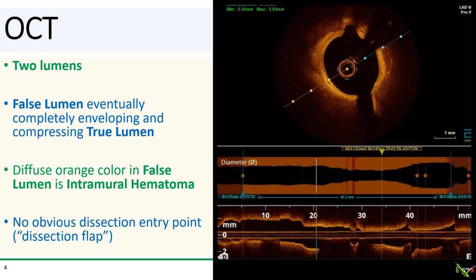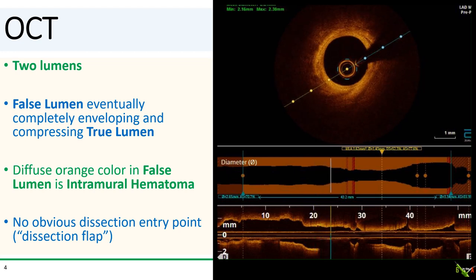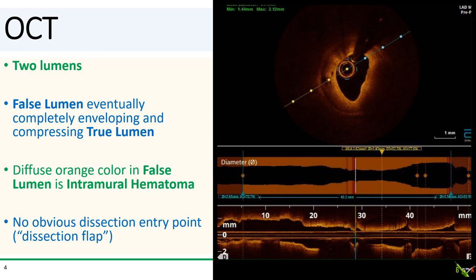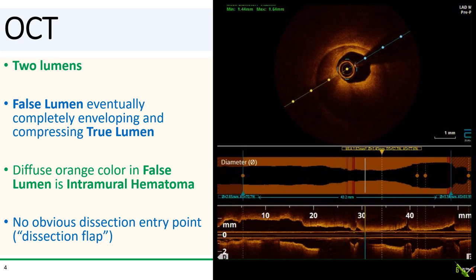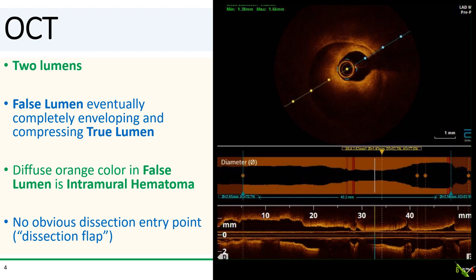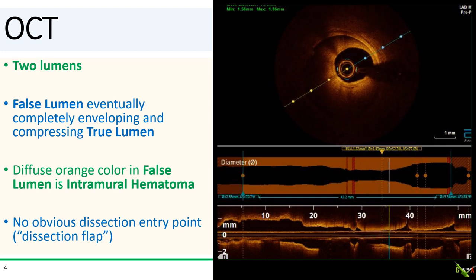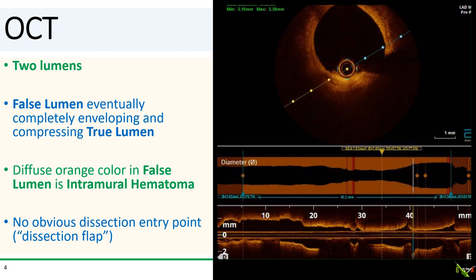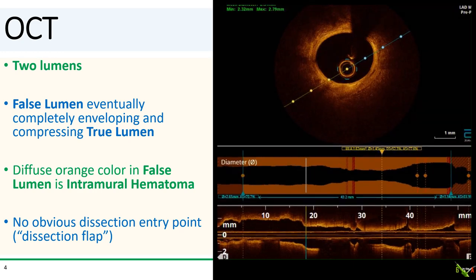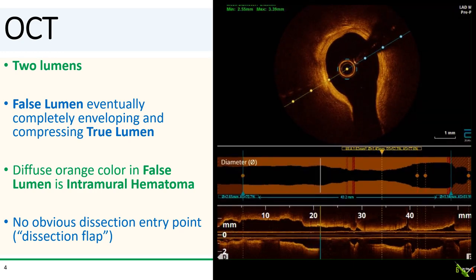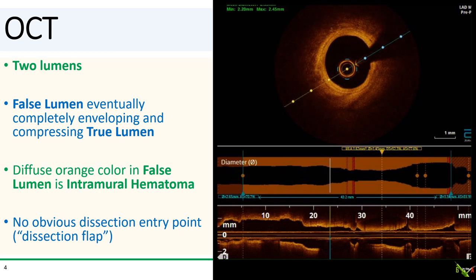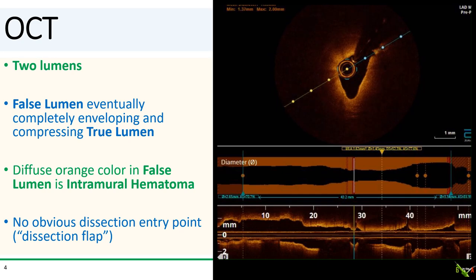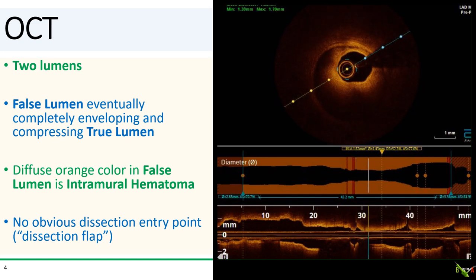So, here is the OCT run. Let's look at it carefully. As we move through the run, you see one lumen becoming two lumens — this is diagnostic for a dissection. The false lumen eventually completely envelops and compresses the true lumen. You'll see a diffuse orange signal in the false lumen, which is intramural hematoma. And if you look carefully, there actually is no dissection flap — there is no point at which the false lumen communicates with the true lumen. This is a case of SCAD, or spontaneous coronary artery dissection.